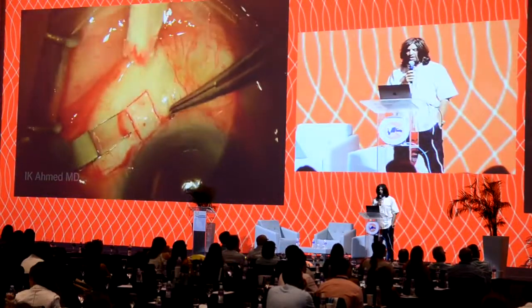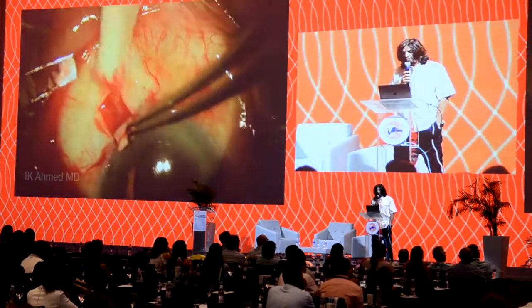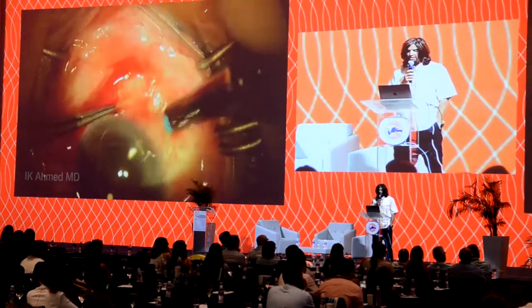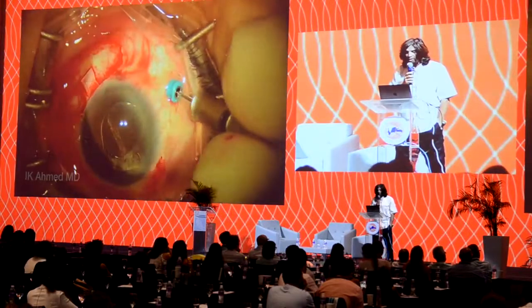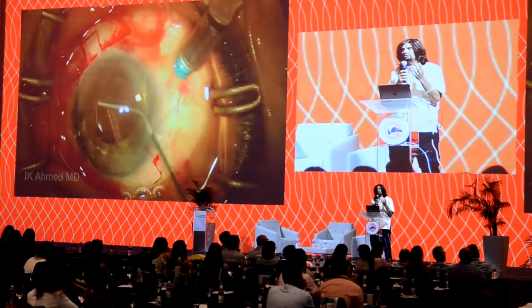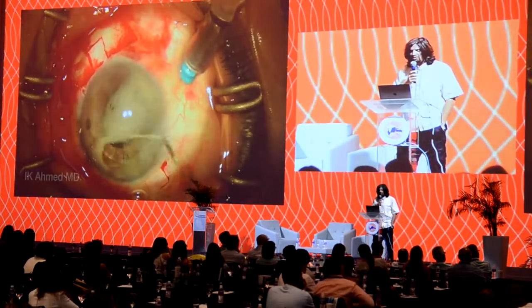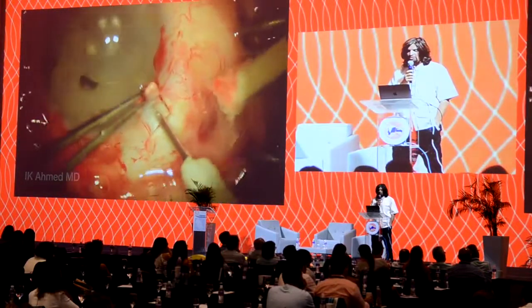Here we're going to prepare the eye for intrascleral haptic fixation, or as some have called it, the glued IOL technique. Now we can use the Yamane technique as well. We put in infusion, and the patient has a vitrectomy. It's nice to have some infusion in the eye because the eye can become very soft during the manipulations. We're injecting some triamcinolone just to be sure there's no vitreous.